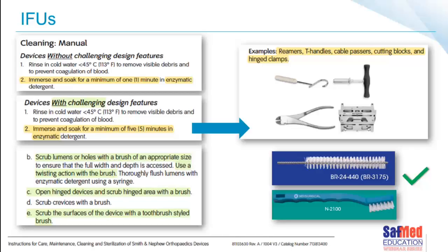because they have to tell you that if you follow these instructions, at the end of the day you will have a cleaned device. And that's their responsibility, because they can't just design something and say, here you go, use this, this will do the job, it's perfect. But how on earth are you going to clean it? So before they can sell it to you, they have to have done this.